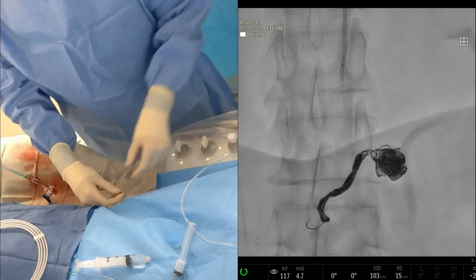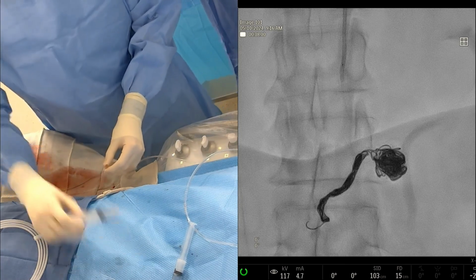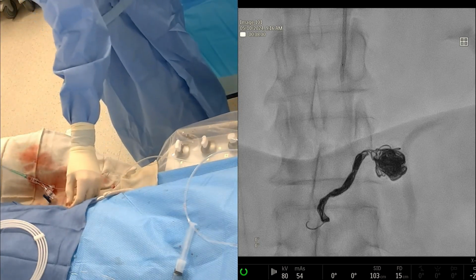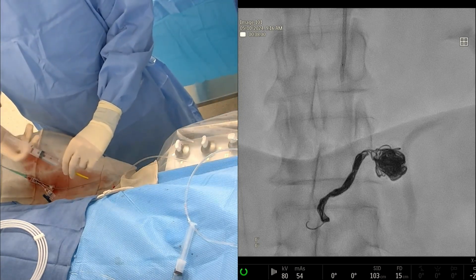Rahul, do you want to talk to us a little bit about the choice of catheter? I know that you're using a diagnostic catheter here as an access, but there may be some people in the audience that are interested in if you were going to use a guiding catheter, what choices we have from a radial approach. Do you want to talk a little about that?